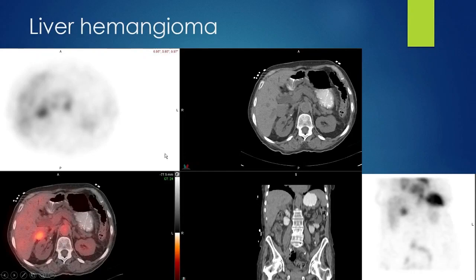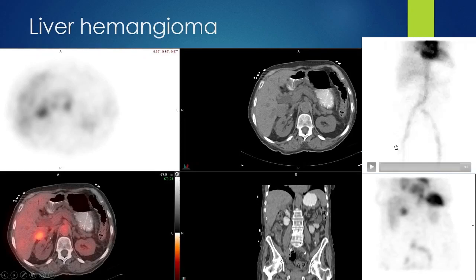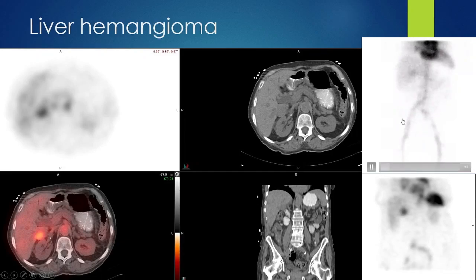Here is a case of a hemangioma on delayed imaging — the early images would show a slightly photopenic area that's hard to see, shown here alongside a diagnostic CT for anatomic correlation. On a GI bleeding study done a few months later for the same patient, only mild accumulation of blood pool is visible on the planar image at 60 minutes in the relevant area.